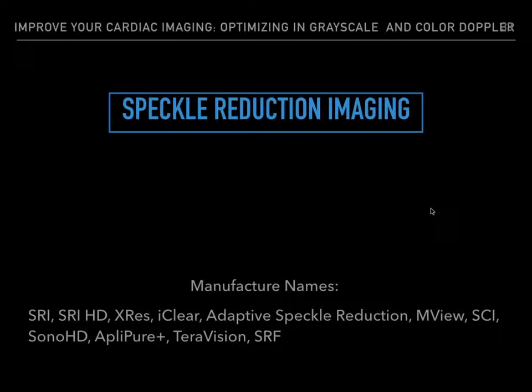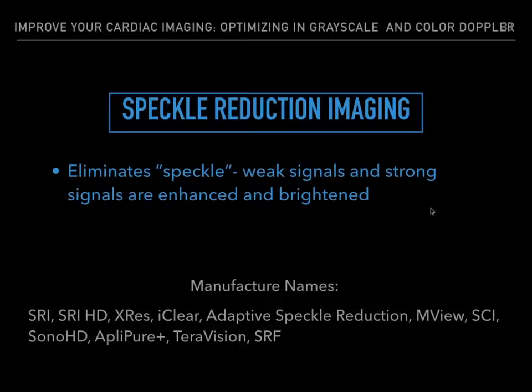Speckle reduction imaging. So this eliminates speckle, weak signals and strong signals are enhanced and brightened. What this does, it actually provides a smoother, cleaner image.